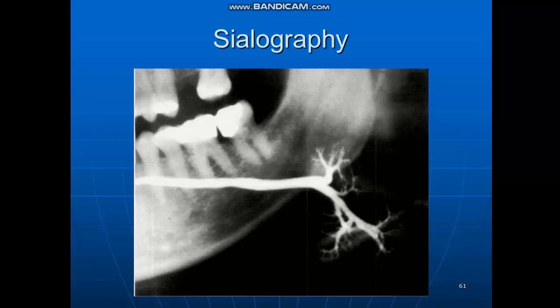The preoperative phase involves taking preoperative radiographs, if not already taken, before the introduction of the contrast medium, for the following reasons: to note the position and or presence of any radio-opaque obstruction, to assess the position of shadows cast by a normal anatomic structure that may overlie the gland, such as the hyoid bone, and to assess the exposure factors.